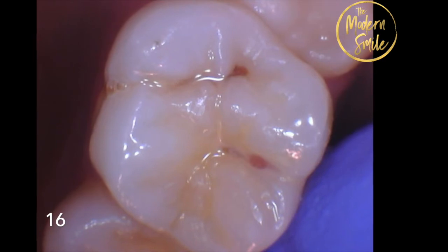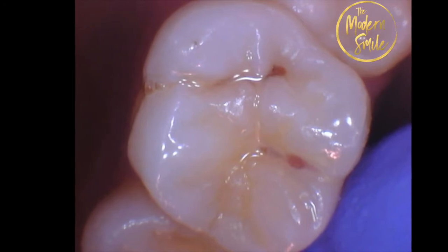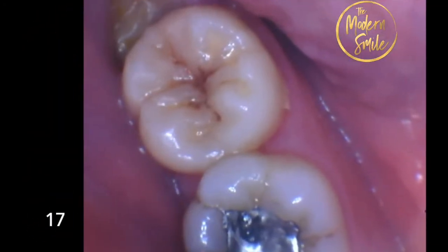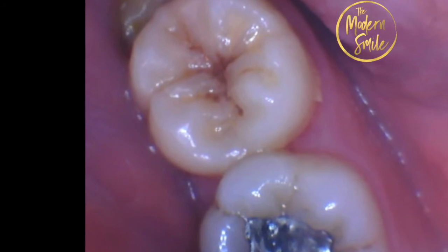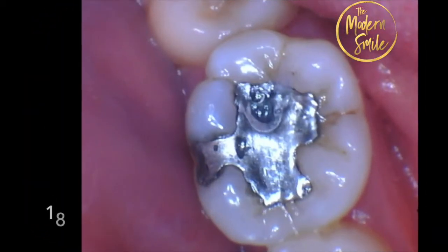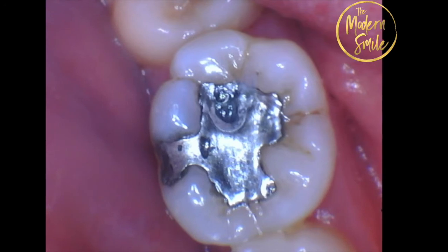This is another smaller cavity, actually deceivingly smaller because those red dots you see there are actually holes in the tooth, so we had to drill out and put a filling. Here's another cavity. I'm actually looking at the one towards the back. There's a cavity there. We had to drill out the dark areas of the tooth to put a new white filling. Here's another silver filling. This is a tricky one because even though it's larger, a lot of the natural tooth is still there.